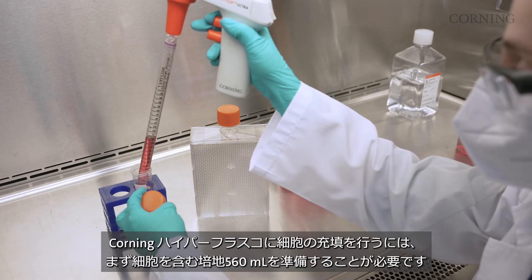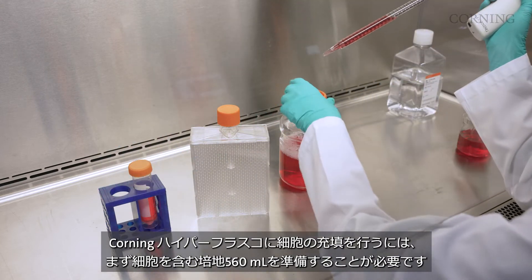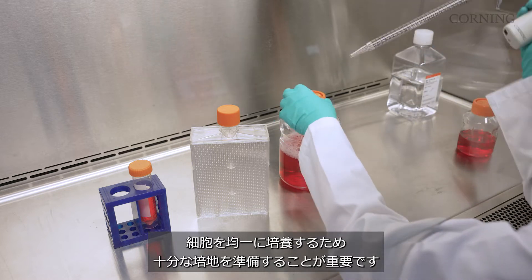To seat a Corning hyperflask cell culture vessel, create a 560 milliliter inoculum of cells. By using enough media to fill the entire vessel, you'll guarantee a uniform cell distribution.